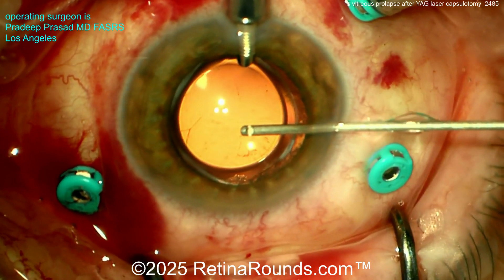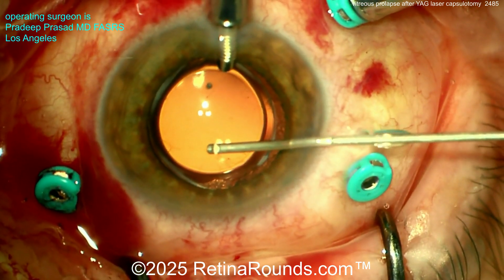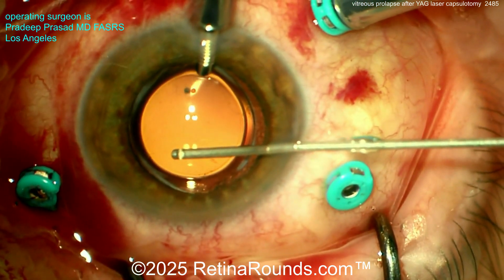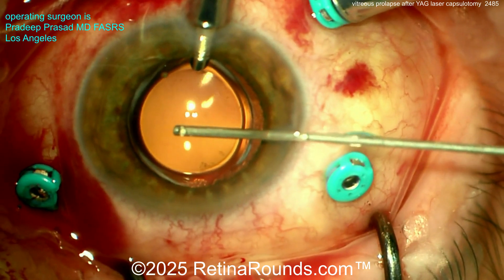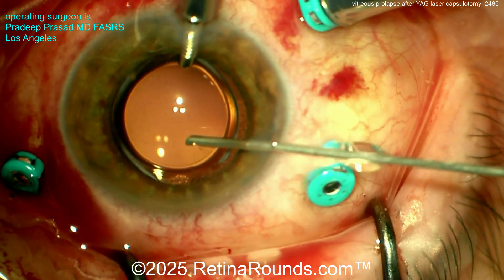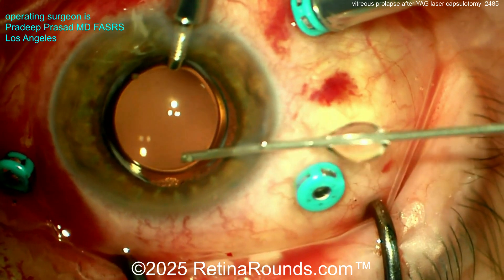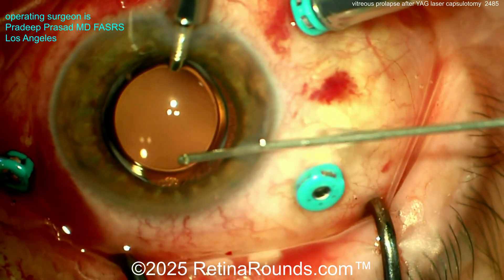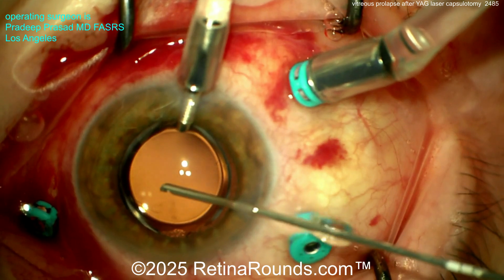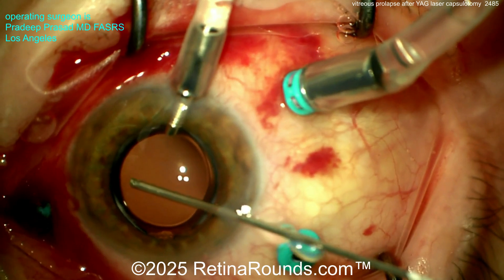We're using the same vitreous cutter in the anterior chamber that we used in the posterior segment. You can see there's not a lot of movement of the vitreous cutter — we're not using it like a wand. We don't want to be moving very aggressively in the anterior chamber, and we want to make sure not to engage any iris. When we see that vitreous is no longer coming to the tip of the cutter, that's when we start to twist the tip anywhere from 45 to 90 degrees to engage any residual vitreous, going all the way around 360 degrees to make sure everything is removed.